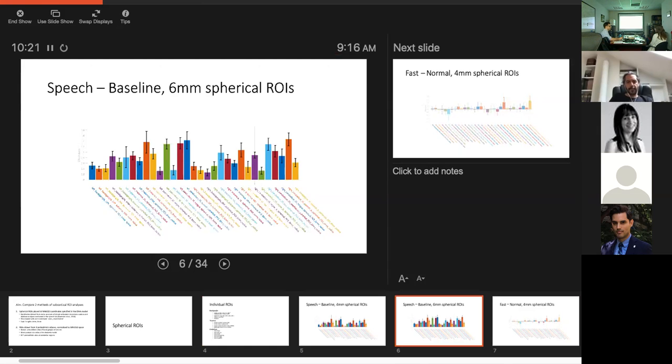Right, and that's kind of the point of what I wanted to discuss later about the issue with the masking, which had to do with how well or badly the subcortical structures co-register after MNI normalization across subjects. We should look at the structural data after normalization and the functional data after normalization, and focus a little on subcortical structures, to get a sense of how much residual variability there is in the exact location of these regions that we care about, even after normalization.